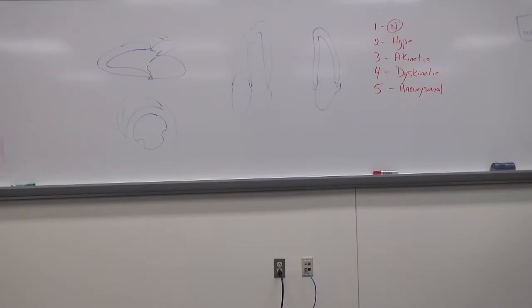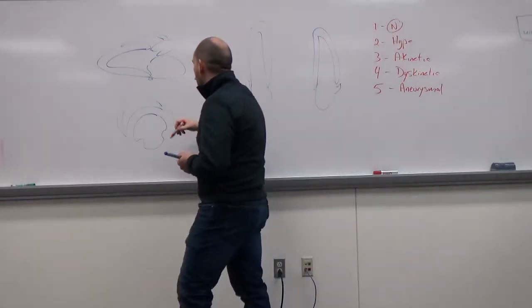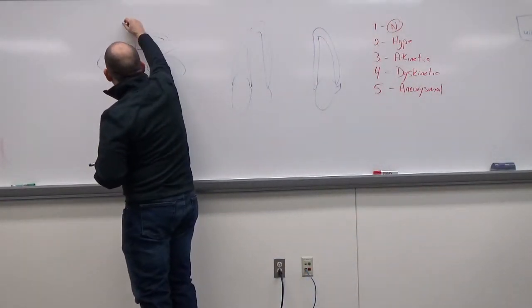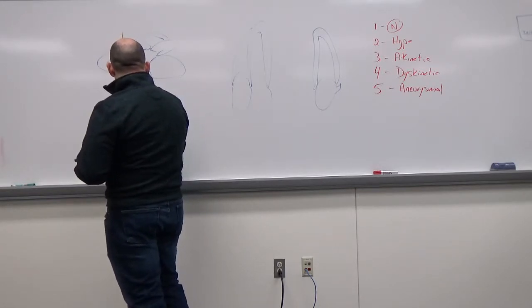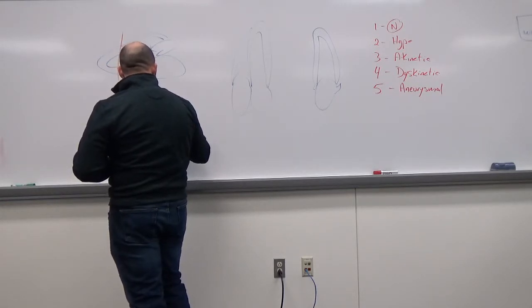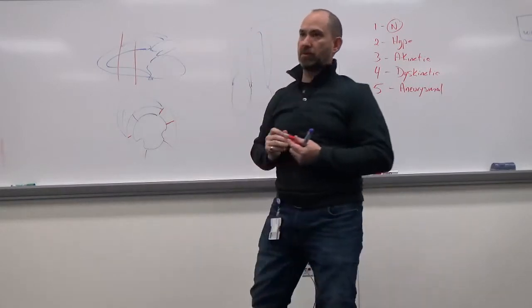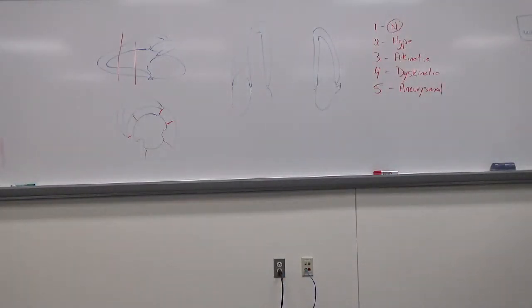What else do we want to know about the walls? So we'll score what their characteristics are. The degree of systolic wall thickening, okay. Oh, yes, segments. So know your segments, okay? When we know the segments, what else are we going to be thinking about?